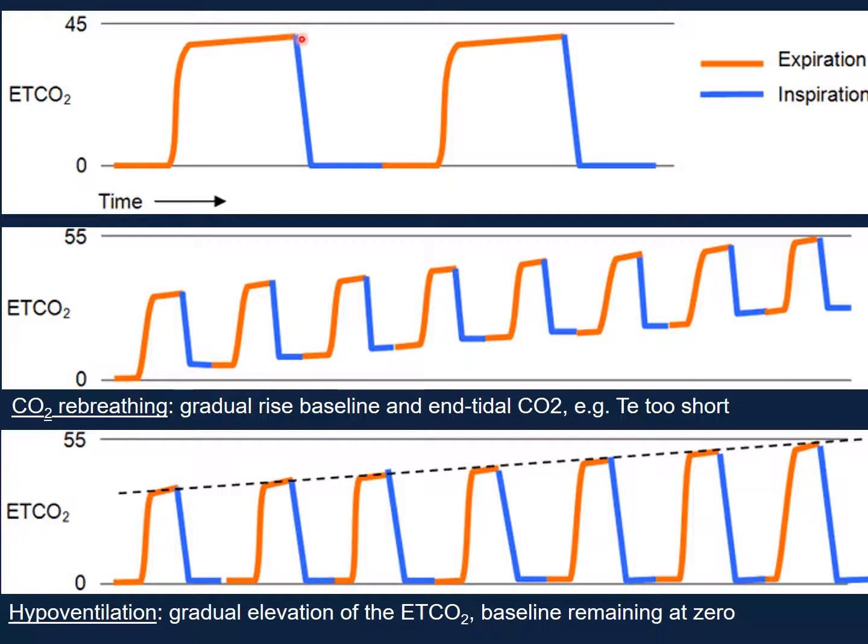Okay. So we are looking at this point. This is the point where the measurement is being taken. The end tidal CO2, the carbon dioxide level in the breath at the end of exhalation.